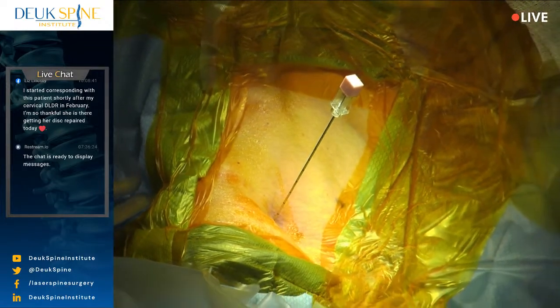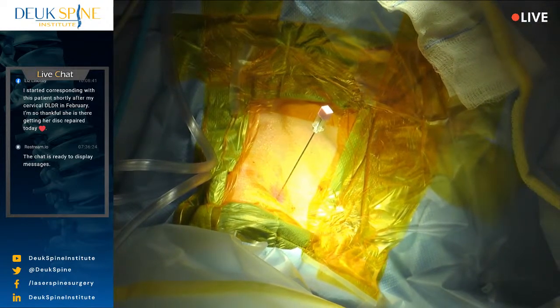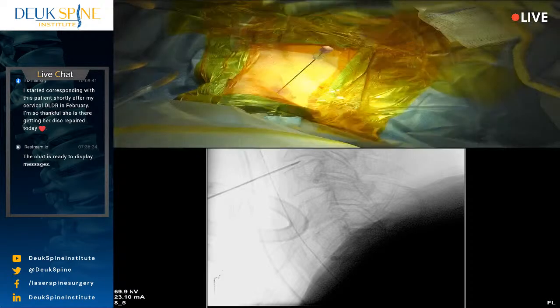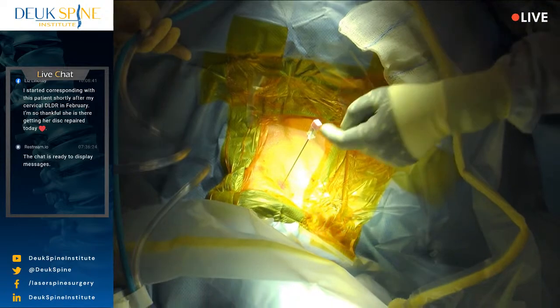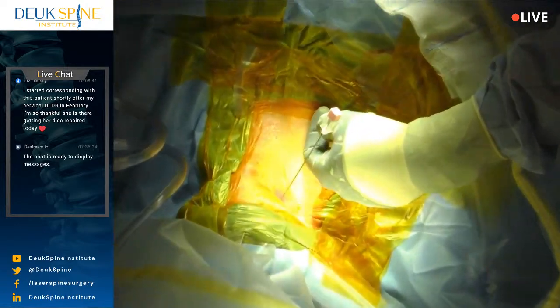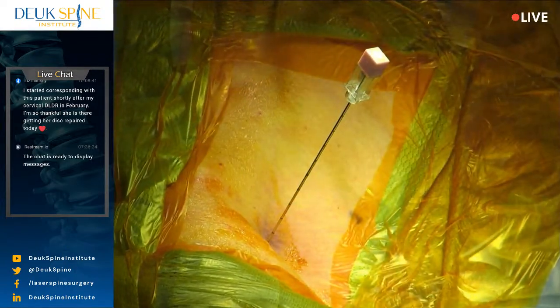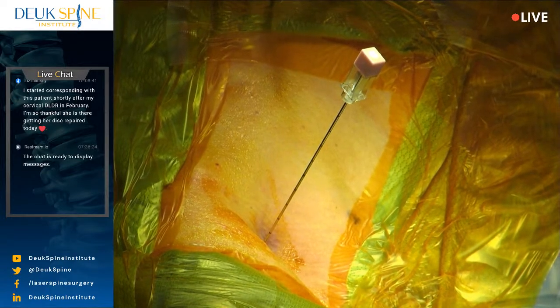All right. So I need you to hold these tubes over because you can see the tube there on the view. Now you have an esophagus tube in, right? Yes. Okay, good. So we got our endotracheal tube. This patient is intubated under general anesthesia, completely asleep, laying on his back. And we also have the endotracheal tube in the trachea. We have an esophageal tube behind that in the esophagus. So I can actually feel those tubes with my fingers, and that way I can displace them to the side with my fingertips as I touch the spine.